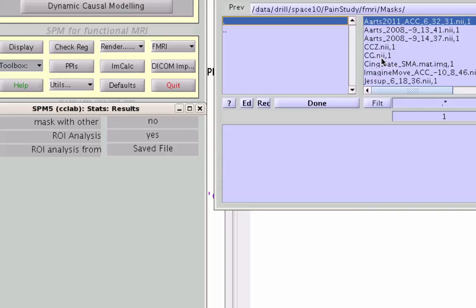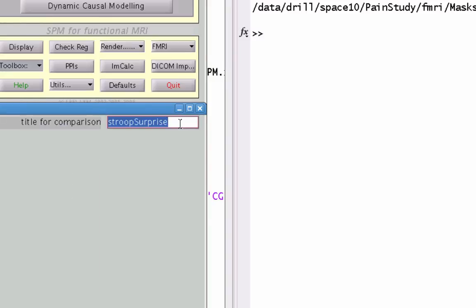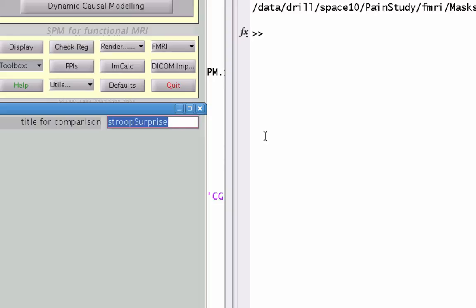I have two ROIs I'm going to focus on right here. One is CG, one is CCZ. With CG being a more anterior cingulate ROI, and CCZ, the caudal cingulate zone, which is more posterior.